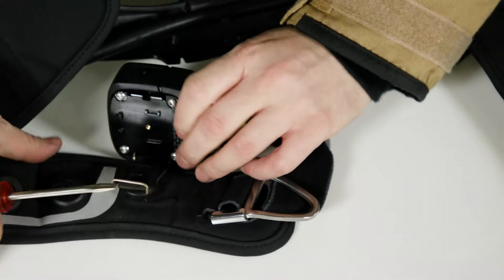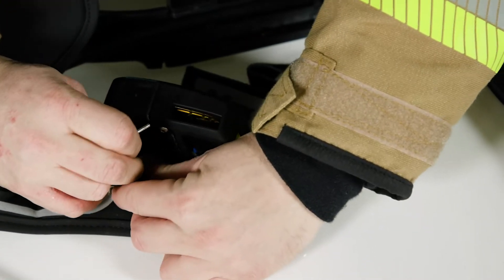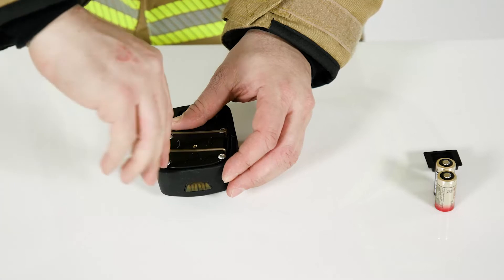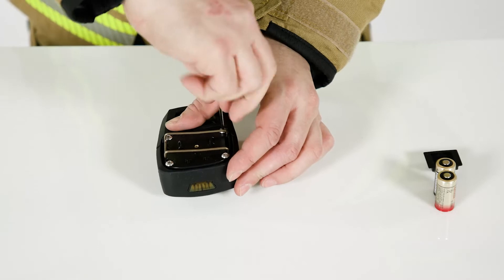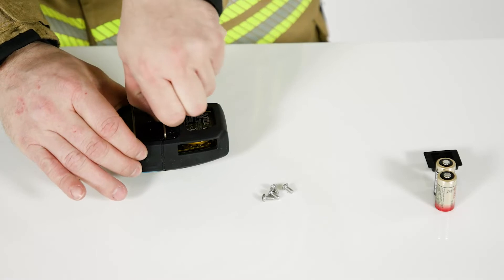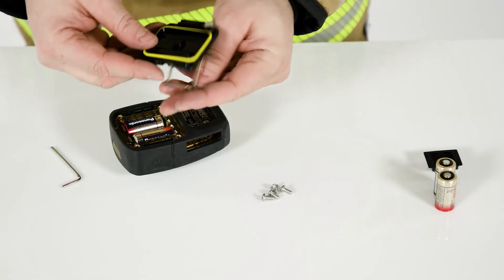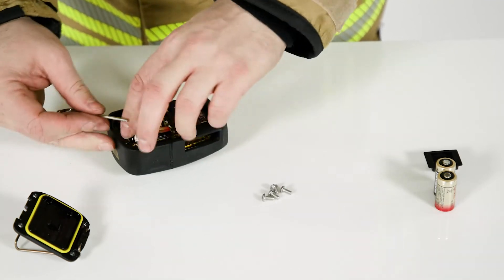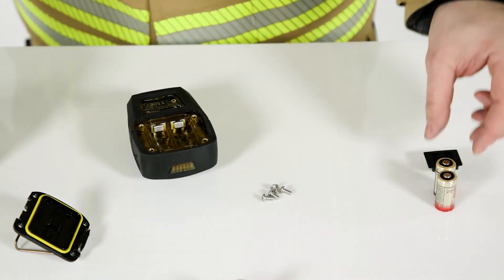To replace the battery in the PASS device, detach the PASS device from the waist or shoulder strap. Unscrew the four screws on the top. Take off the battery compartment lid.